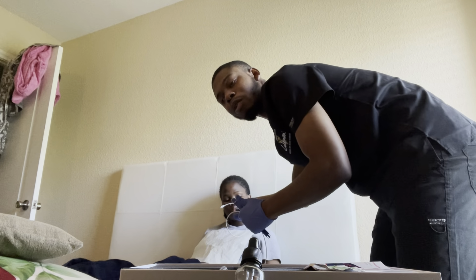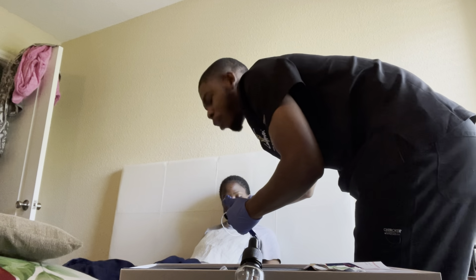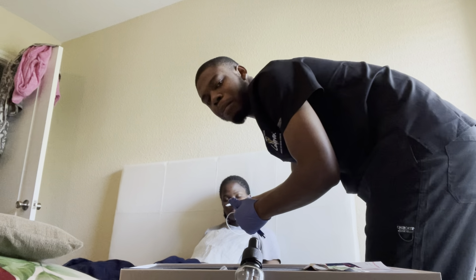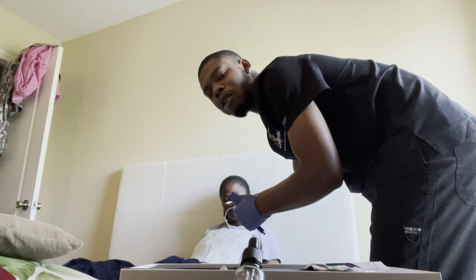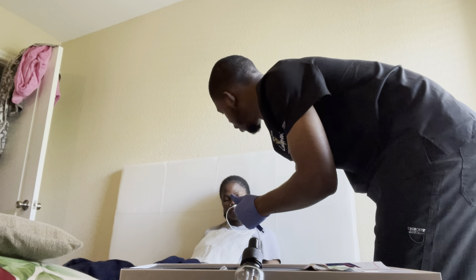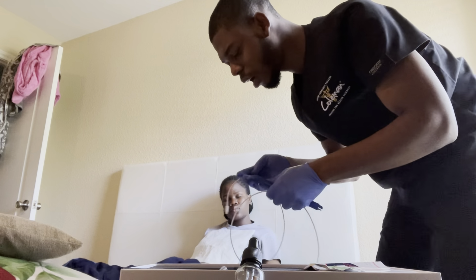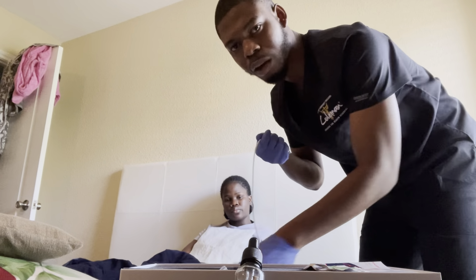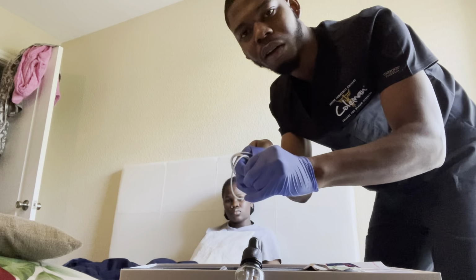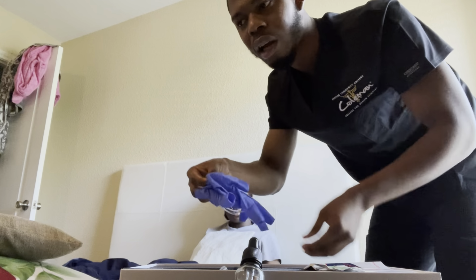When I'm done inserting it and done with the suction, I will carefully remove the catheter by rolling it back and forth through the patient's nares, and at the same time performing intermittent suctioning by placing my hand over the vent for about 15 seconds or less. And I will take out the catheter. I will take the catheter and roll it over my hand. I will take out my glove and I will dispose of it.